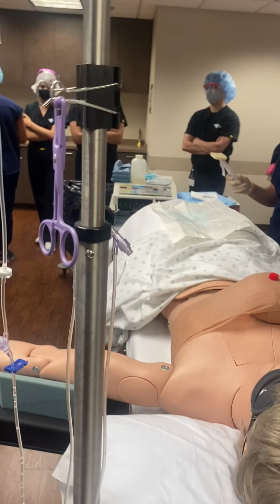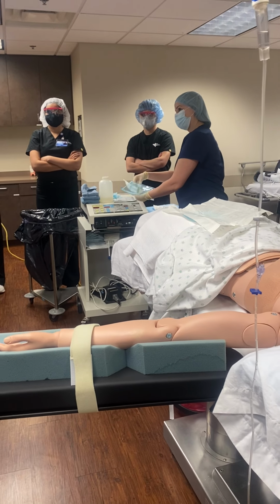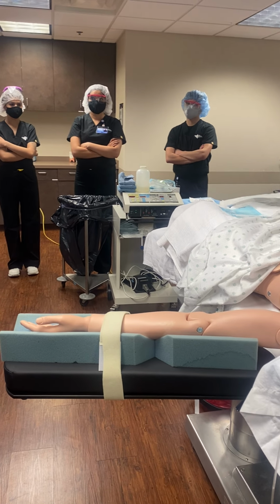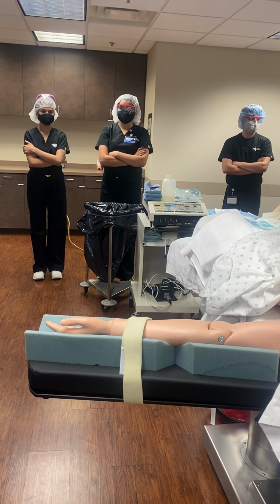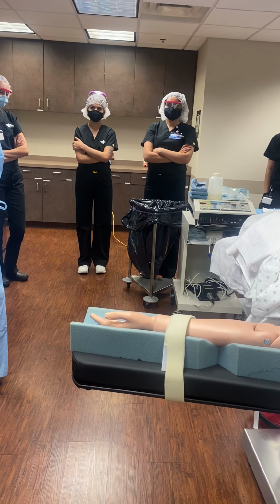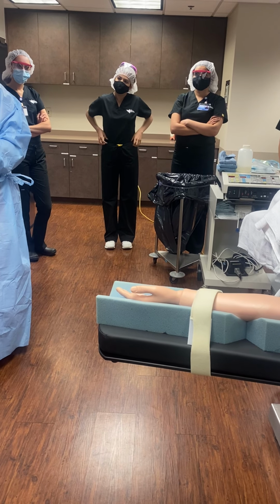3 minutes. And if you have really good surgeons, they will allow that 3 minute dry. Banner now has a kitchen timer on the wall that has 3 minutes, and they hit it because they had a fire there. Because of prep. They didn't wait for the dry time, and a lot of times it'll pool in the belly button. Here, we're not prepping the abdomen, but that's where it has a tendency to collect, the little pool in the abdomen. And so they went to use the cautery, and nobody had dried up the belly button.